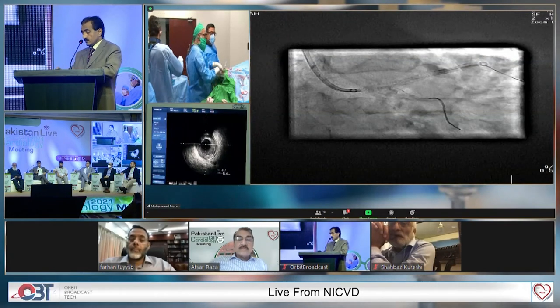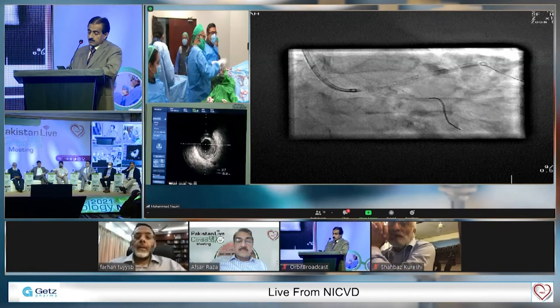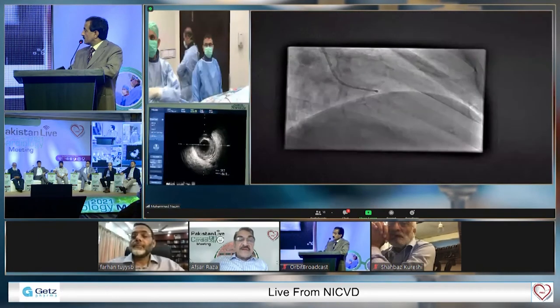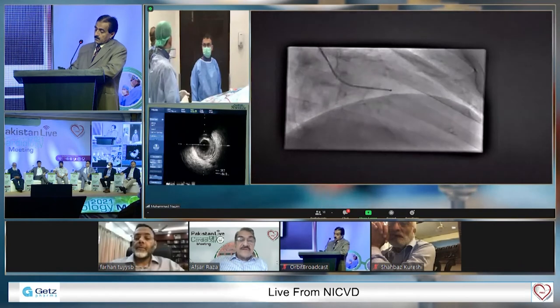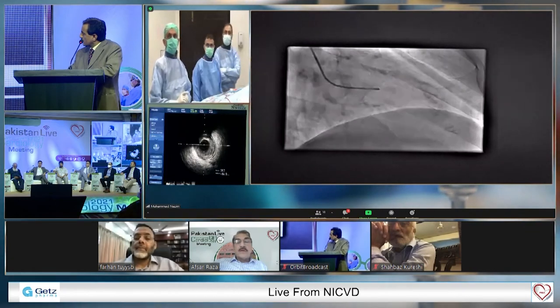General Farhan, the second lab is ready. I think you can be moved to that lab till we complete the case, and we'll show the final result. Okay. But I agree with Dr. Bashir, we must see if there is anything on the ostium. Have a good injection with nitrates and then see. I will request Dr. Bashir to please take us to the other lab.